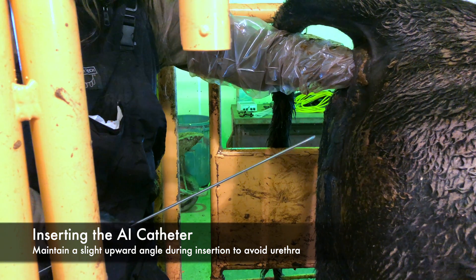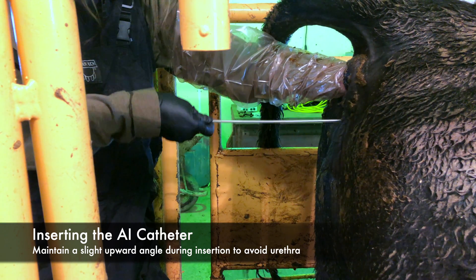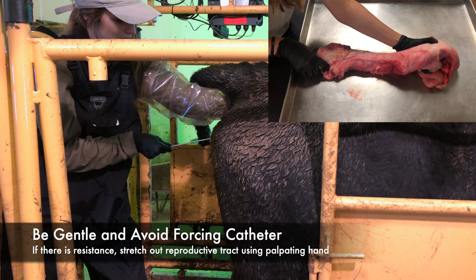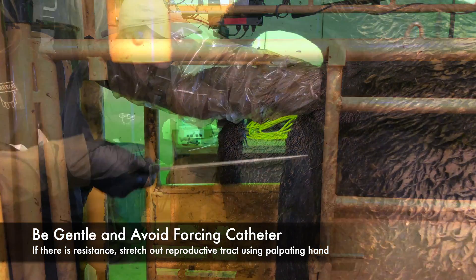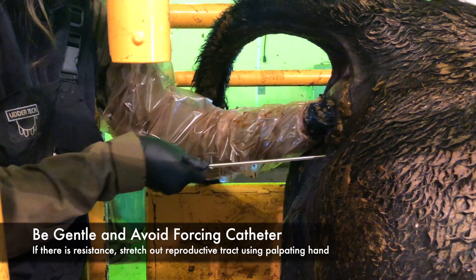Insert the catheter into the vulva at a slight upward angle to avoid the urethra. Begin to level out the angle of the catheter as you gently push the catheter forward into the tract. If you feel resistance at this stage and the gun is not proceeding easily, the catheter is probably caught in a vaginal fold. You will likely need to take a firm hold of the cervix and actually push it forward within the animal. Gently readjust the depth and direction of the catheter with your free hand until you can easily guide it further into the tract.